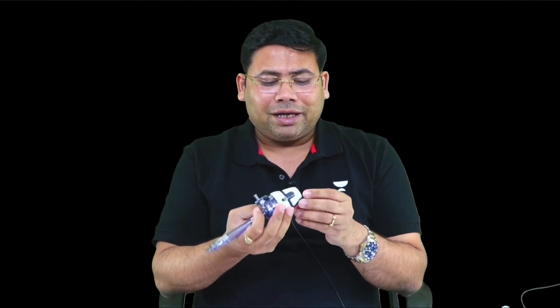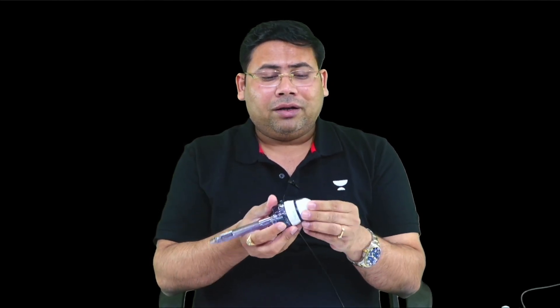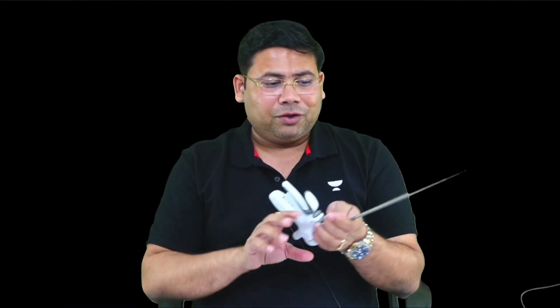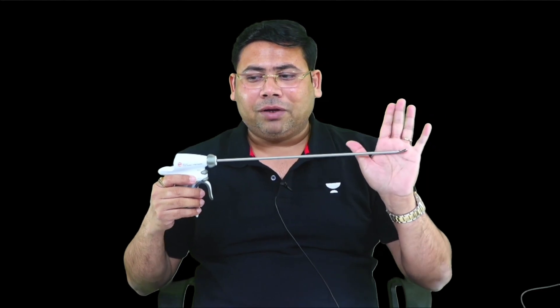This is a bladeless trocar with an optical port — it is called an optical port because you can see what is present inside. It gets locked: once the lock engages, the camera gets fixed and will not come out. This was an image asked recently in an exam — Harmonic — and many people were not able to identify it.